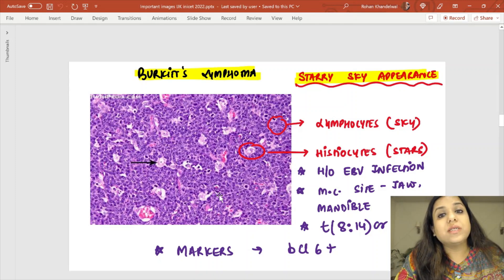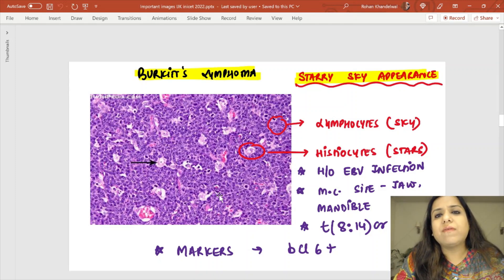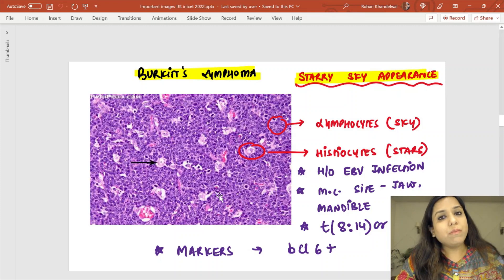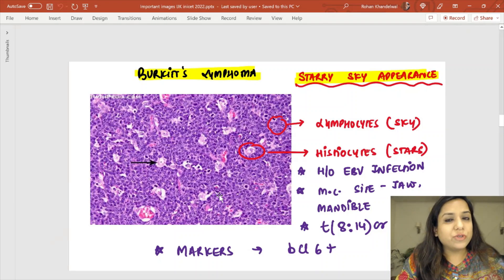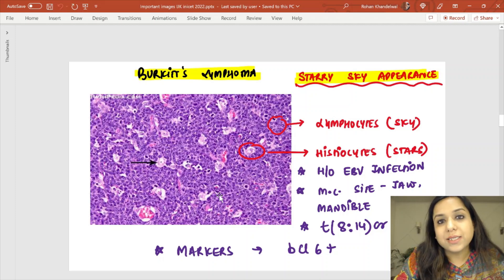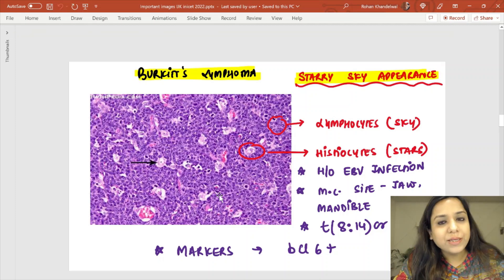Burkitt lymphoma also has a very high proliferation index. The marker for proliferation index is Ki-67.